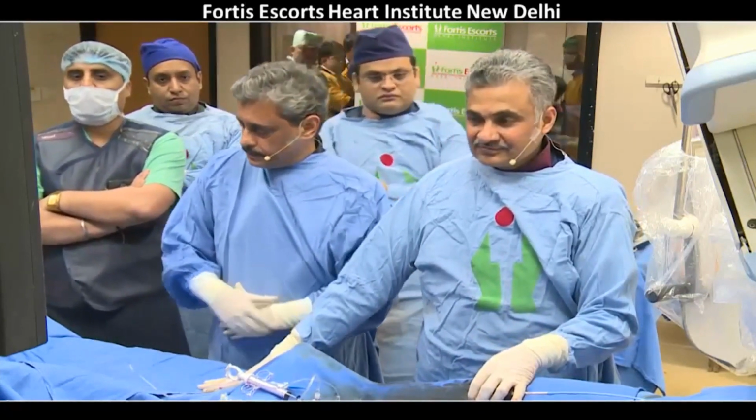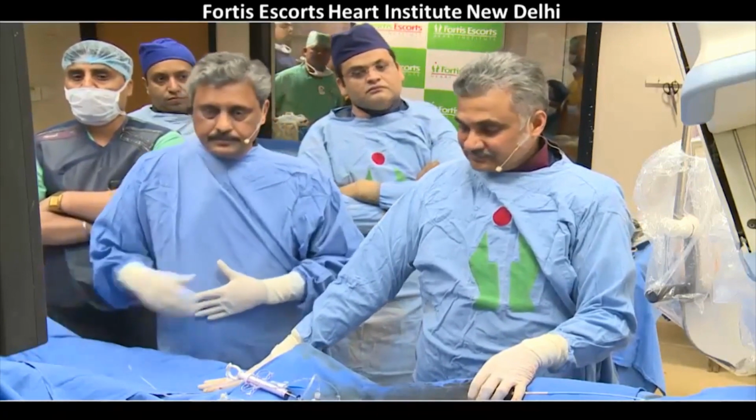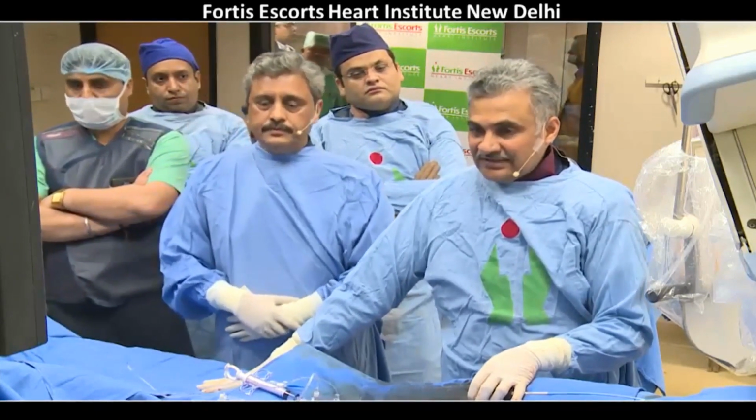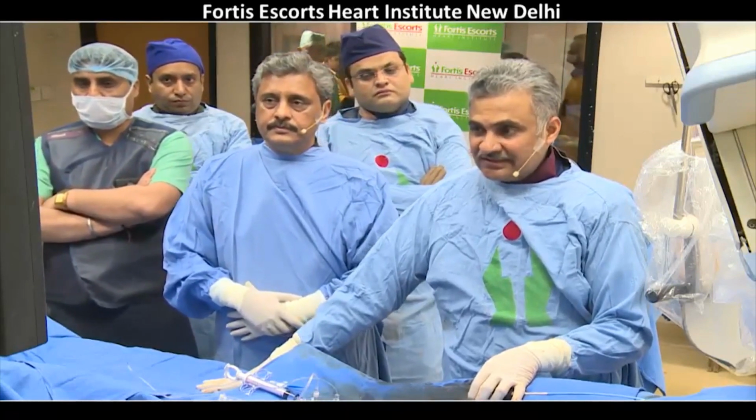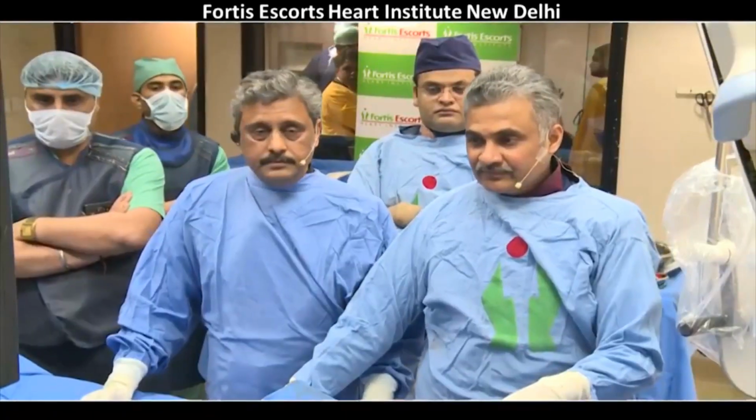But let me take you one step back. Why not bypass surgery? You see, the distal vessels are too small to be bypassed. The LAD has got diffuse disease, and the PDA all along.